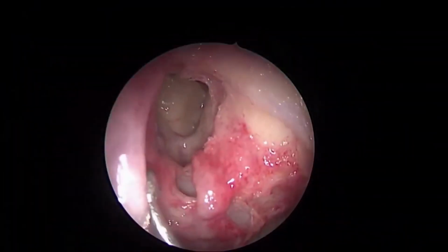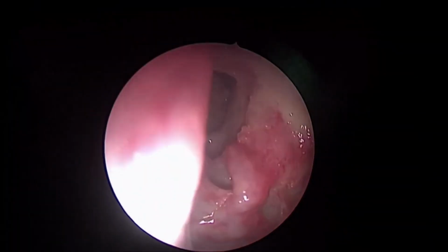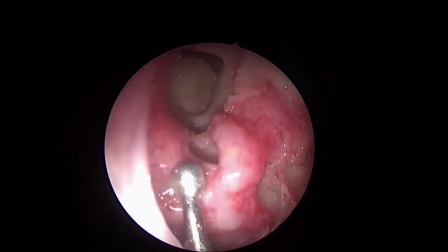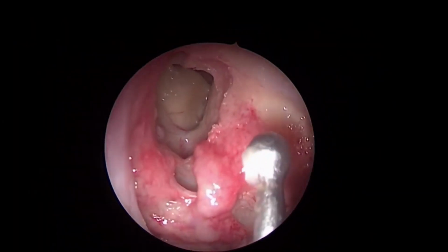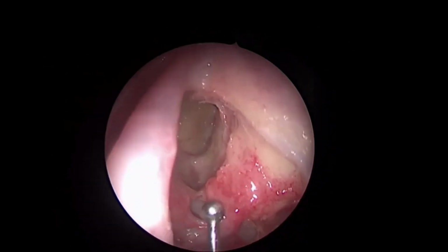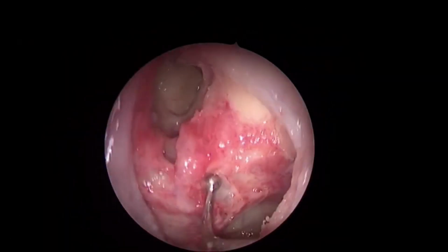Sir, I am coming to it because I have not touched the third part, the anterior ethmoidal artery. See, my bulla is intact, and I'm still not worried about any other complication like the anterior ethmoid so far. I'll tell you the reason, sir. I'm coming to it. I'll definitely address this.